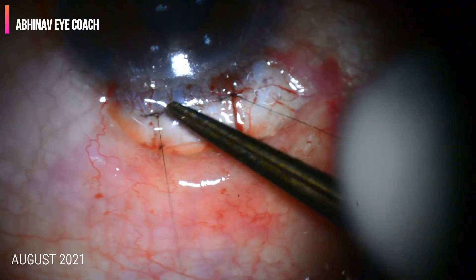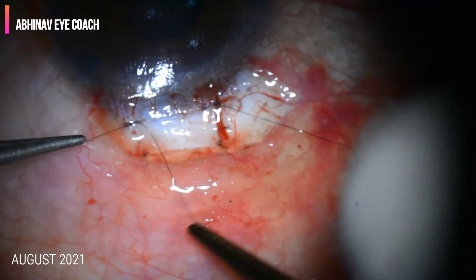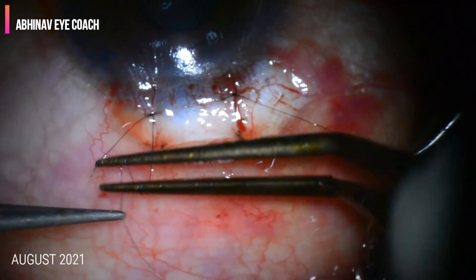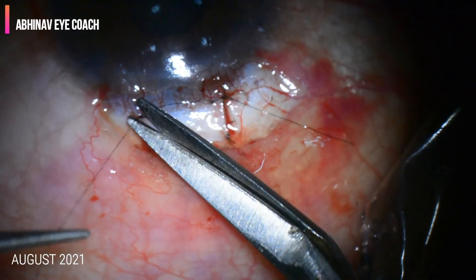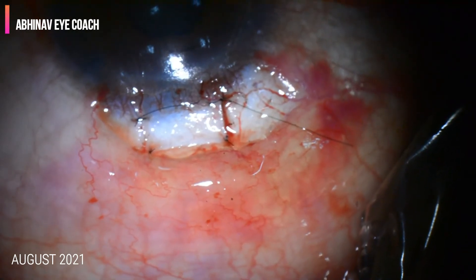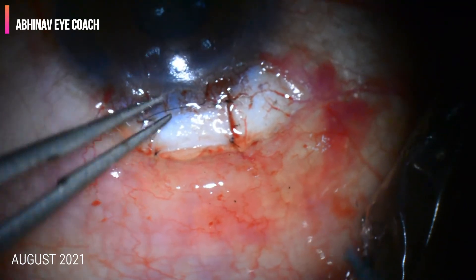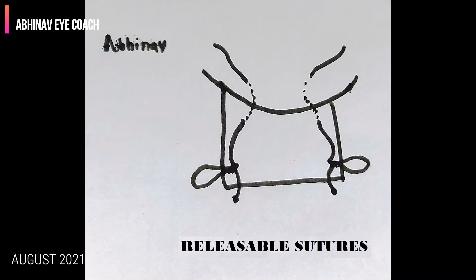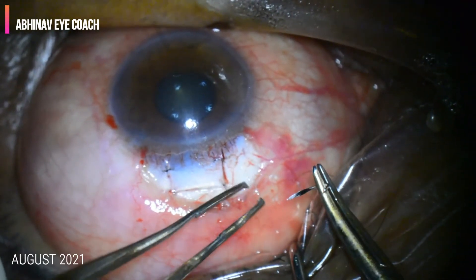The anterior chamber should be formed at all times intraoperatively. The intraoperative pressure should not be very high or very low — it should be around ten. You can feel it digitally at all times. Now we are going to place the releasable sutures. This is the technique of the releasable suture.